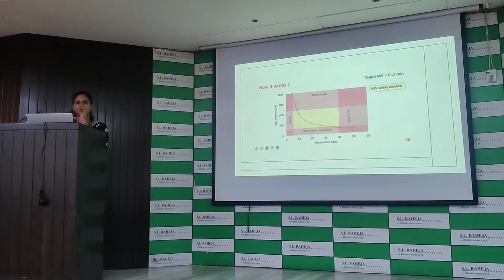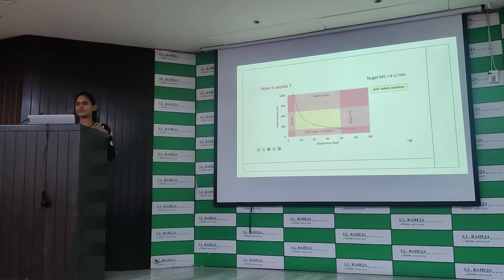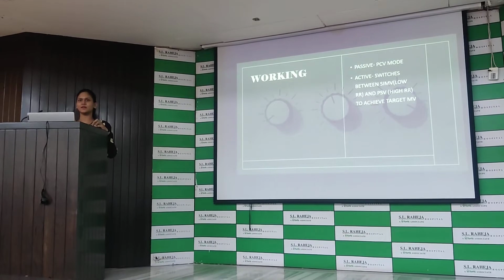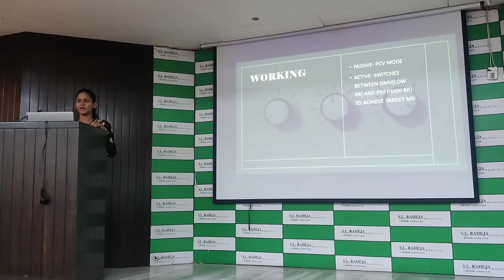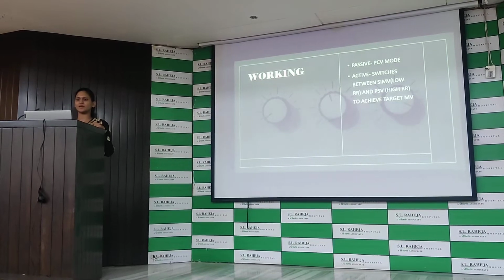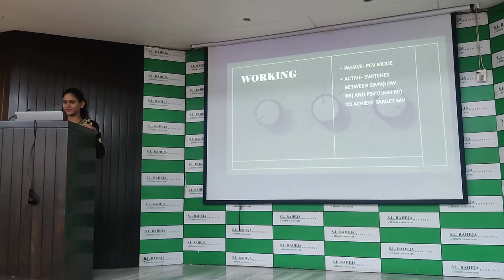And then it will make the adjustments to bring the respiratory rate and tidal volume into the safety window. Now in a passive mode, it works like a pressure control mode, and in an active mode, when the patient is breathing, it will switch between the SIMV mode and the PSV mode to achieve the target minute ventilation.